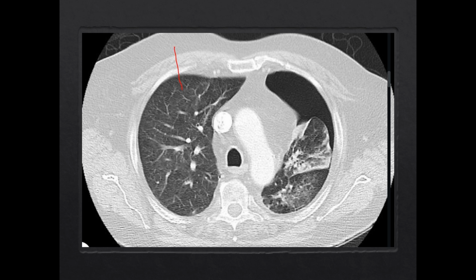If I shoot ultrasound signal down this way, then because this is healthy lung, I'm going to get a lung slide across this line. If I shoot that ultrasound signal down this way, I'm going to get that second image, the one that was on the right, where there's no movement along the bottom beneath that pleural line. I'll get the same image here. I'll get the same image here. Depending on the depth, I'll get the same image here. But then when I go right about right here, I'll start to get a different image.